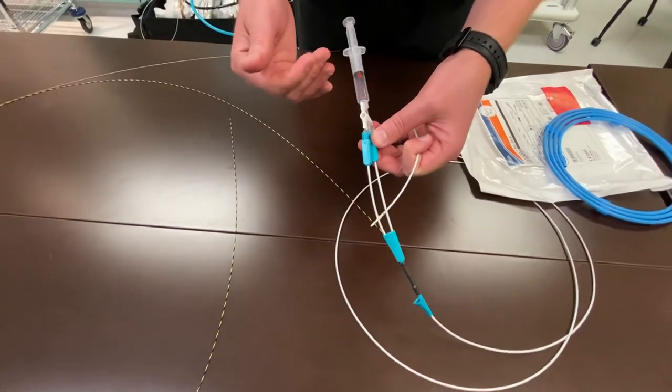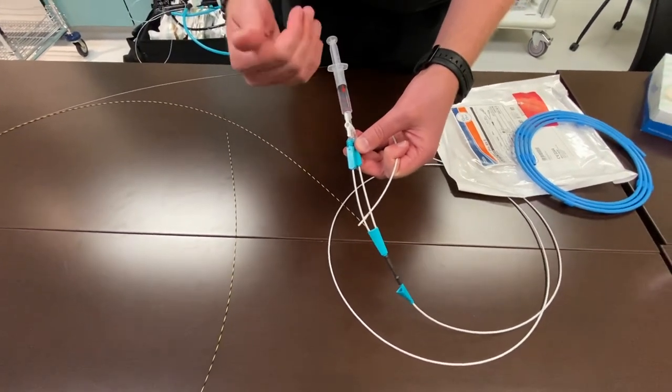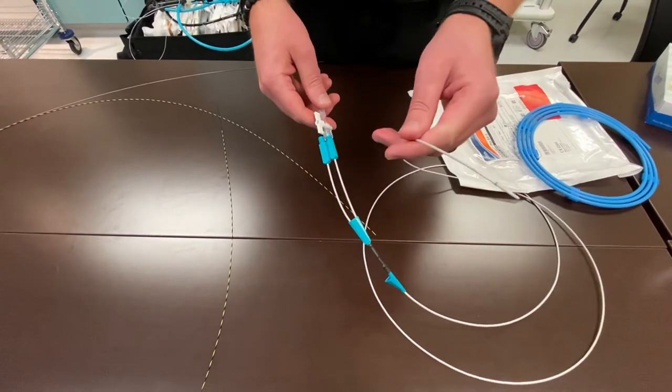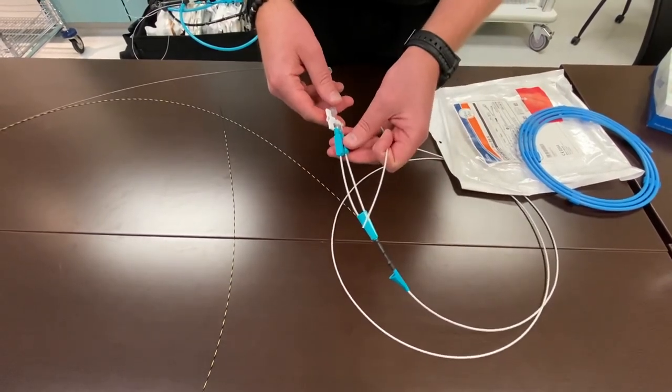When the balloon exits into the duodenum after a sweep is completed, always deflate the balloon entirely so that the balloon can re-advance up the guide wire in preparation for a second balloon sweep.